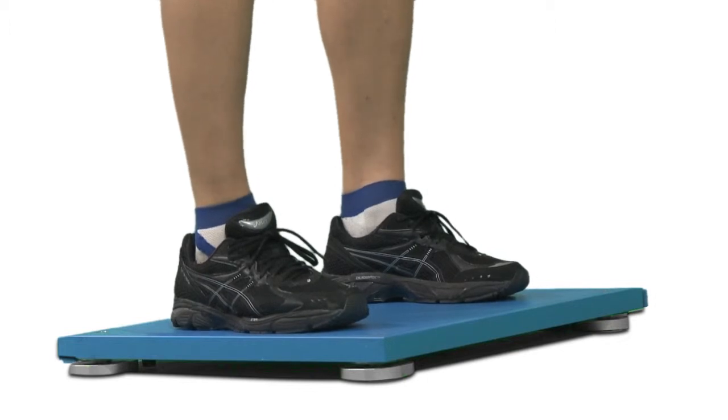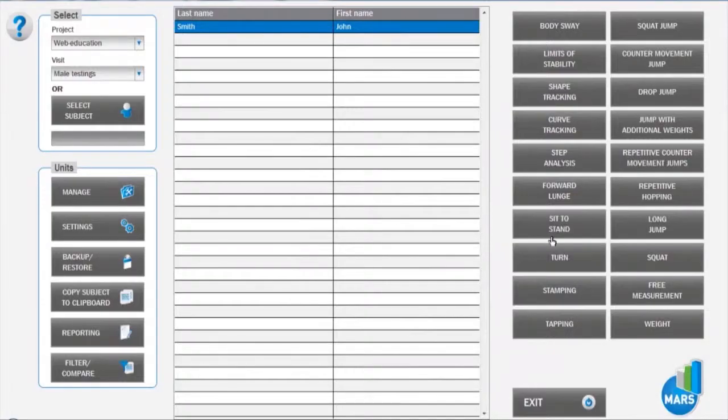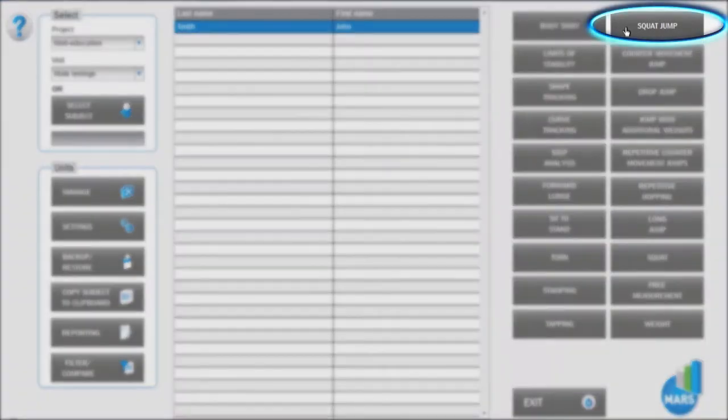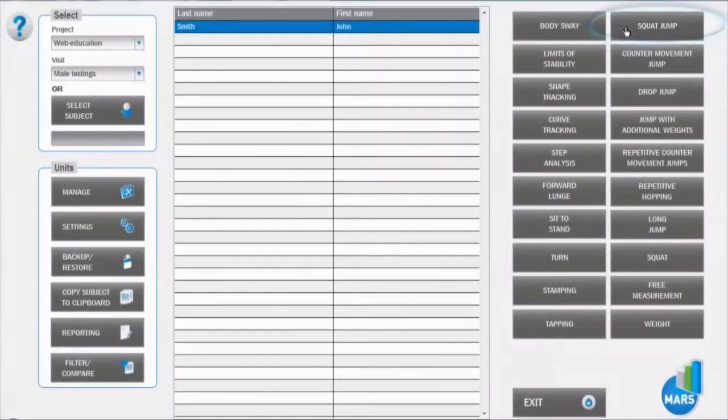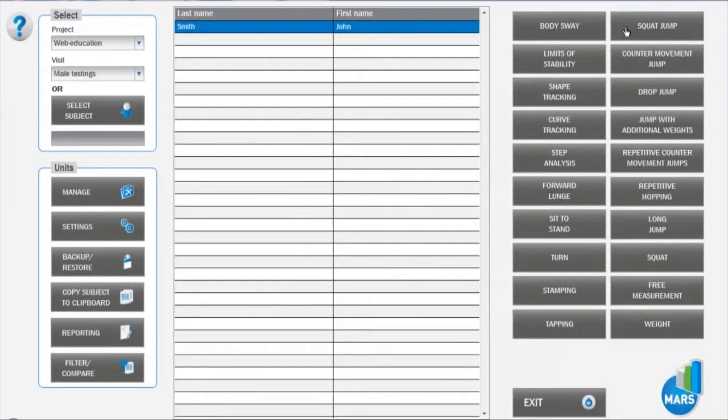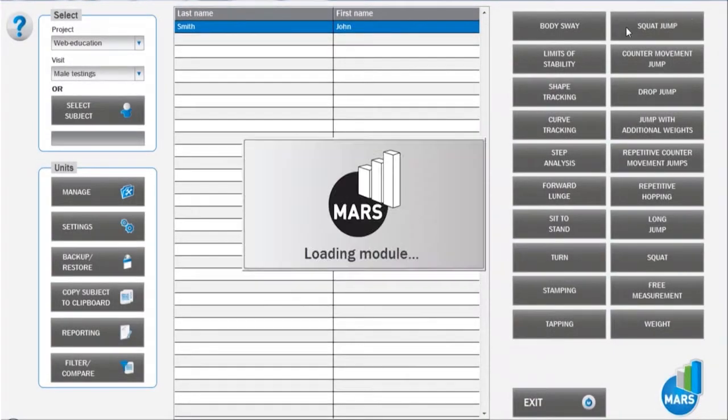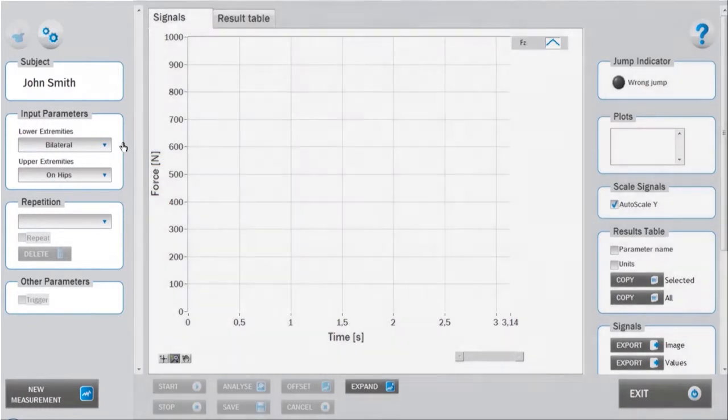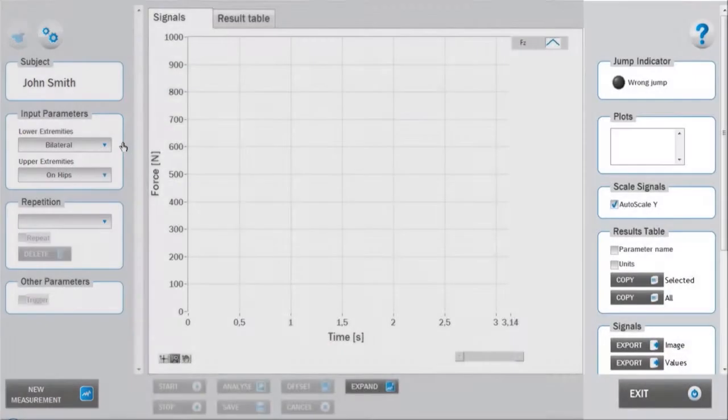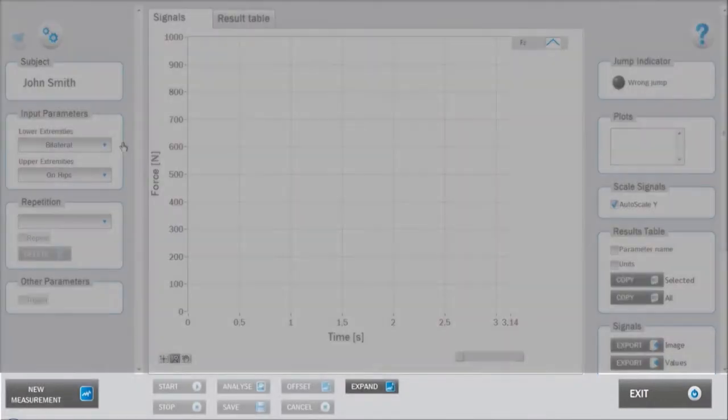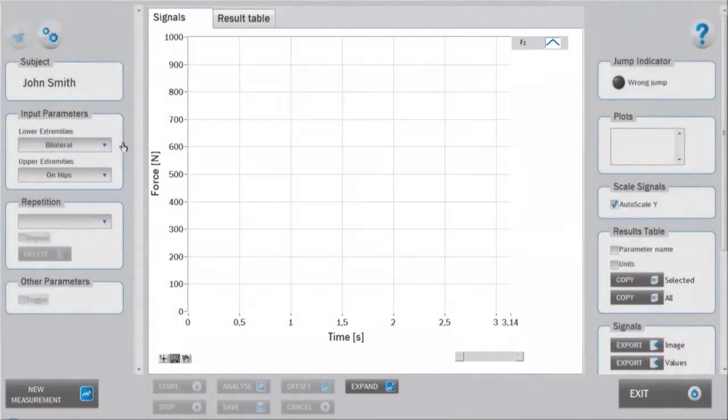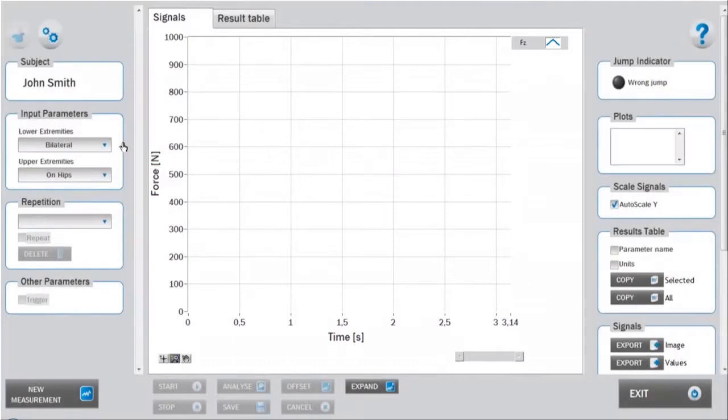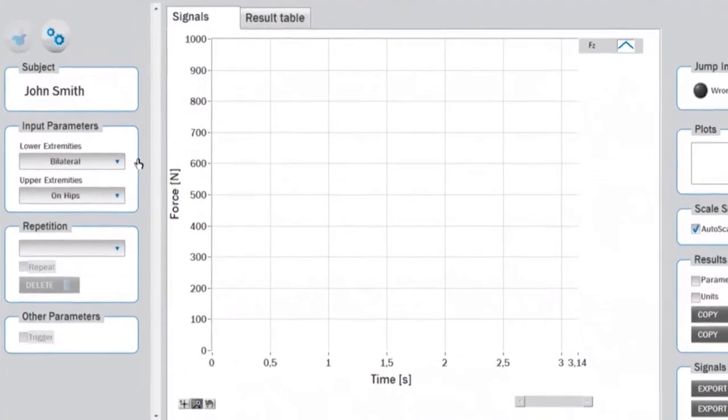Enter the squat jump test module from the main window by clicking on the squat jump button. Make sure you have acquired the subject's body weight beforehand. Consistently with the organization of all Mars test modules, the interface is divided into a left setup panel, a right analysis panel, a bottom measurement panel, and the central signals and results area. Before starting the measurement, appropriate input parameters must be determined in the setup panel.